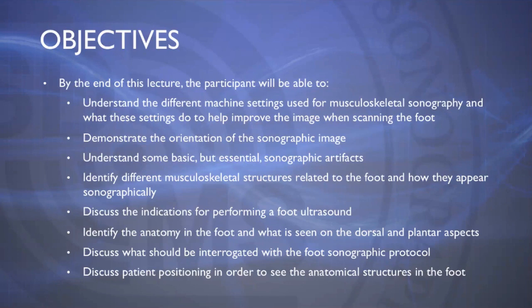We'll then be moving into the indications for performing a foot ultrasound, and then identifying the anatomy in the foot and what is seen on both the dorsal and plantar aspects. We'll also be discussing what should be interrogated with the foot sonographic protocol and the patient positioning in order to see these anatomical structures in the foot.